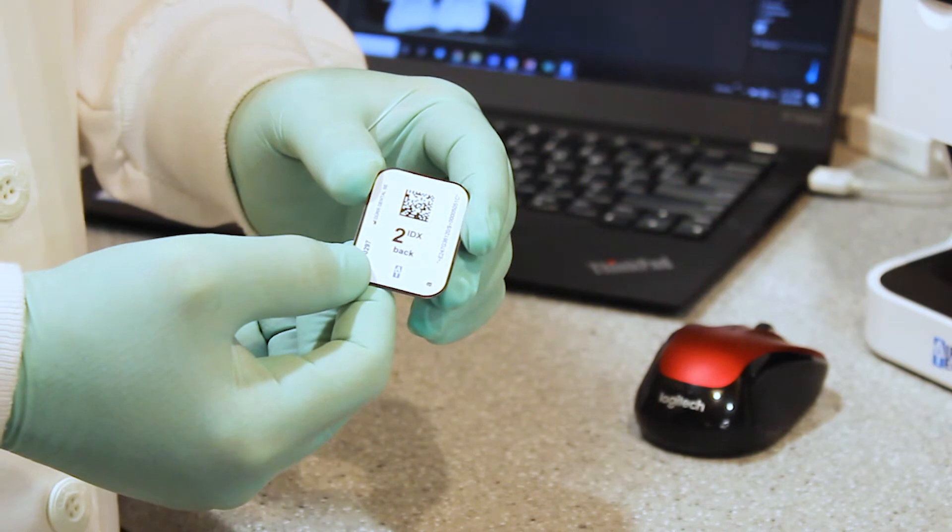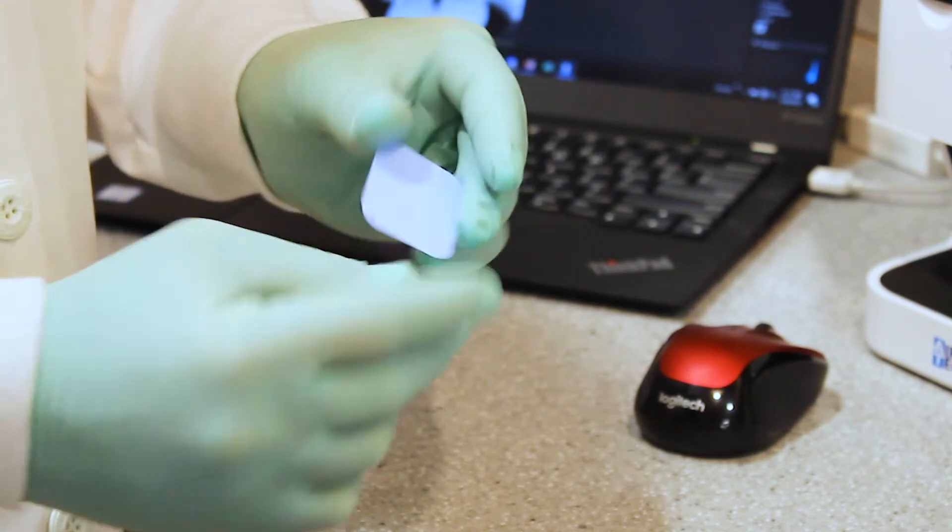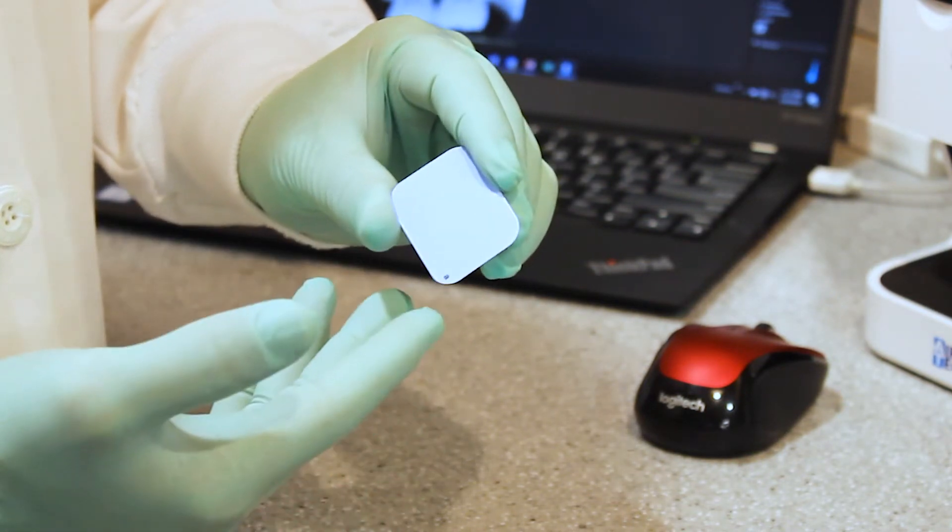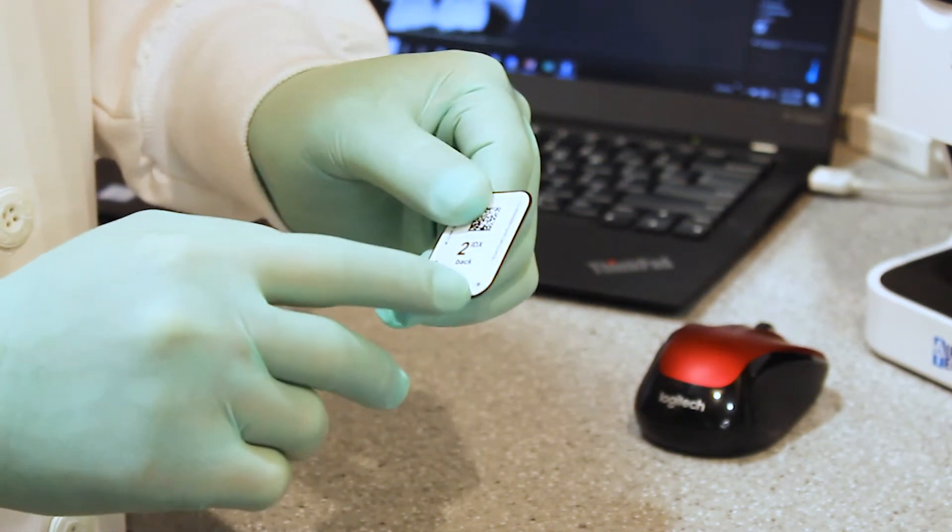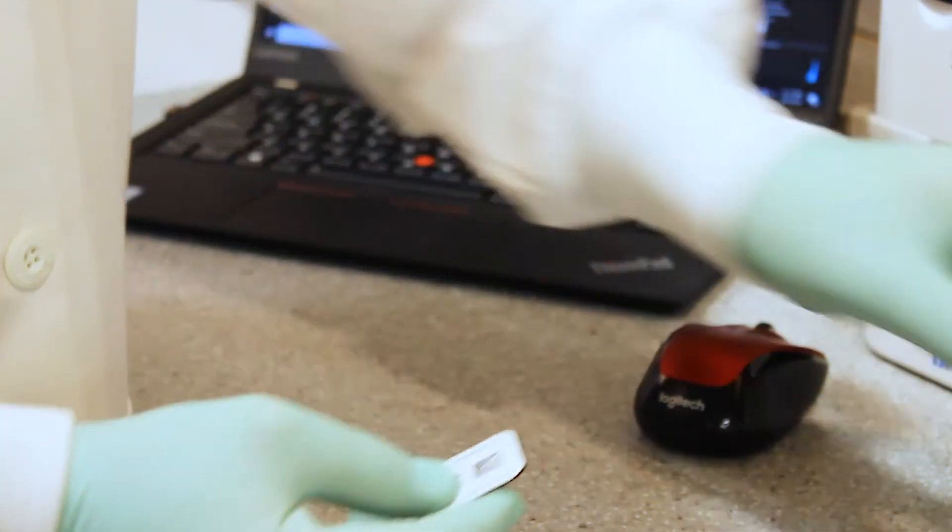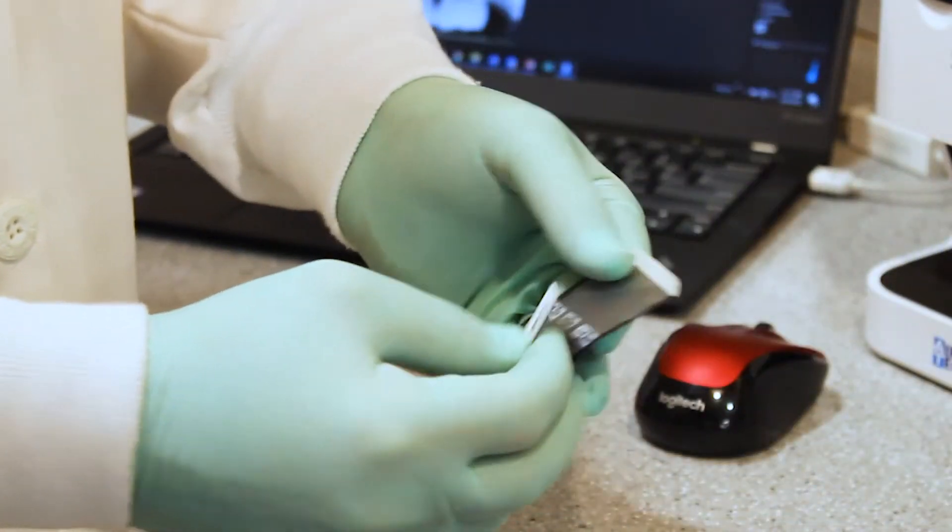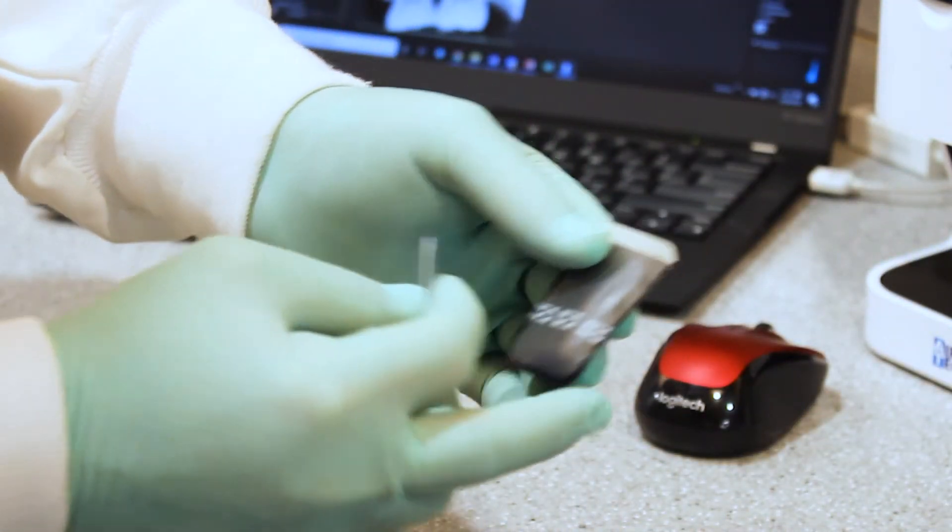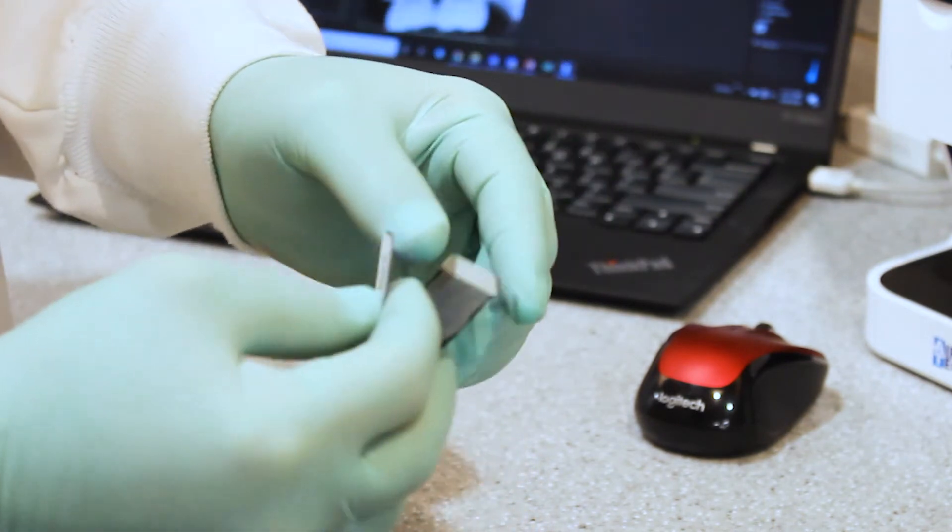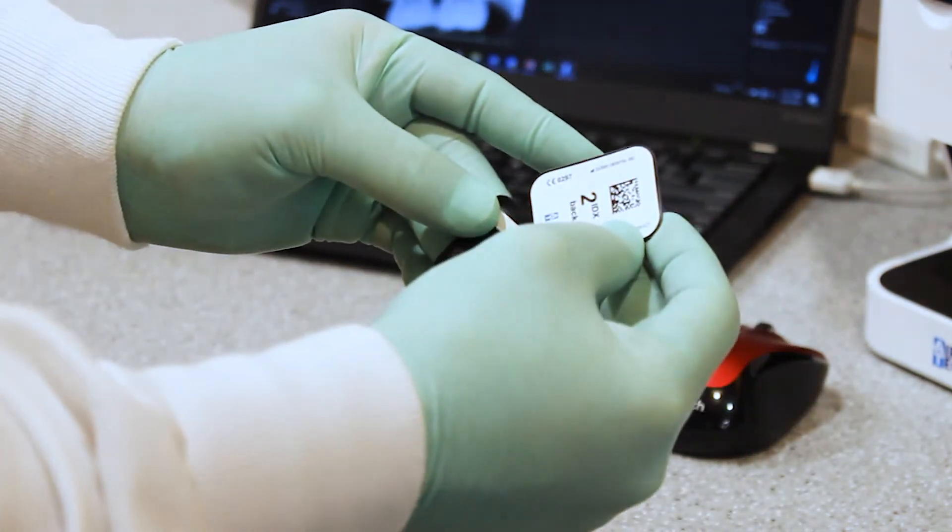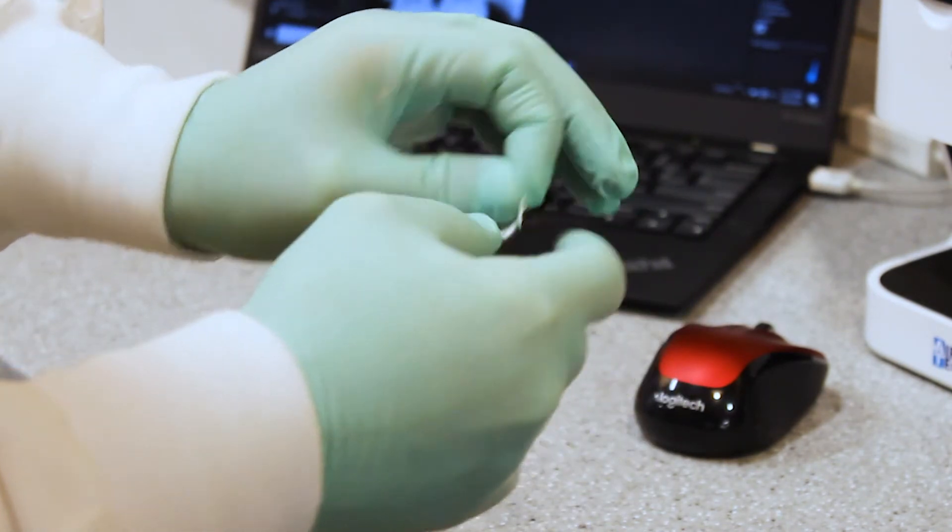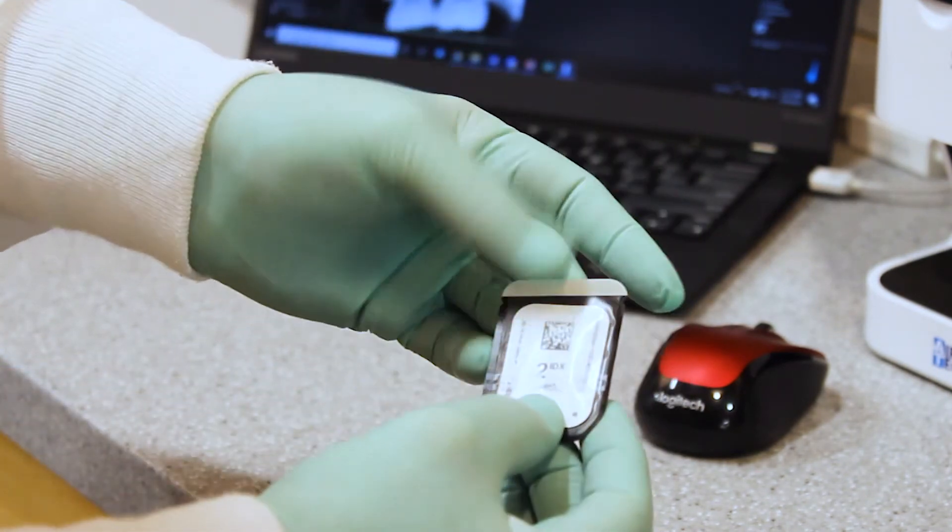This is the IDX phosphor storage plate. We have our non-sensitive side and our sensitive side, just like our existing phosphor storage plates. We have our A indicator on both sides. So these are going to go into our barrier envelope, where we have a clear side and an opaque side. These are the G-Series side-loading barrier envelopes that will get loaded like so. It goes in, as you see here.